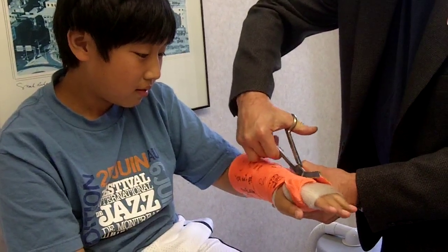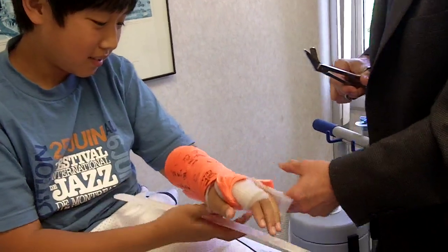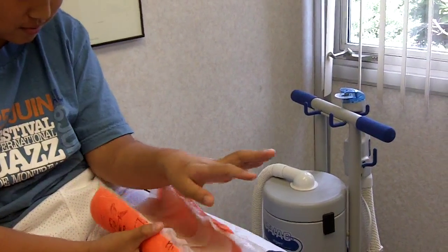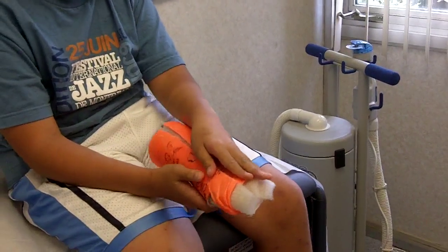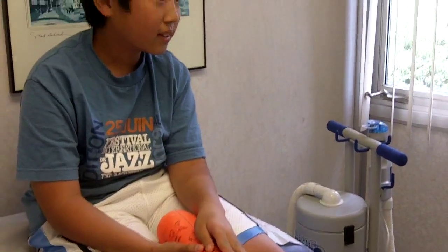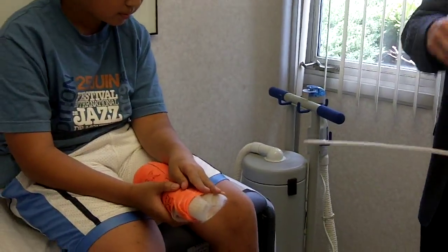I hadn't cut anyone today, so I'm doing okay today. Okay, there you go. What do you think? Does it feel funny? It usually feels really light. And when you move it, it's going to be sore for a while. Does it hurt now? Yeah, that's normal. Expect that. So let's bring you down.